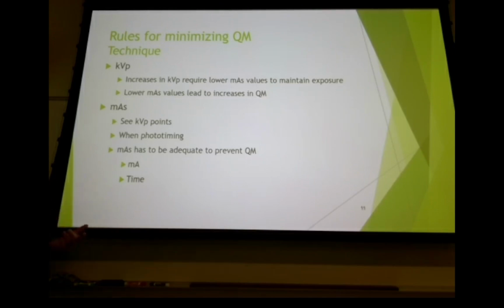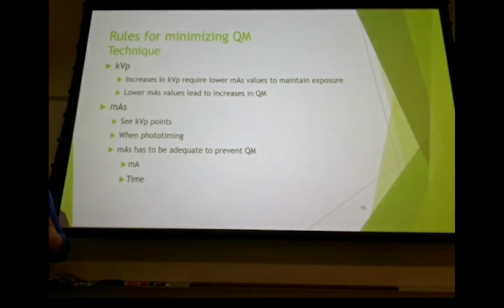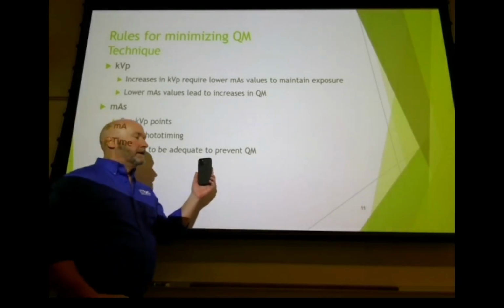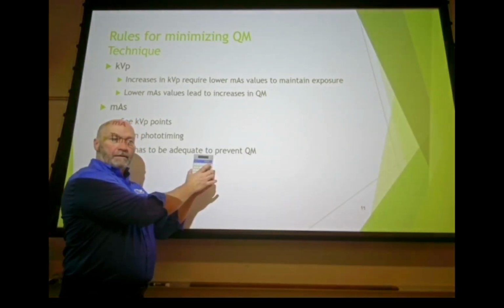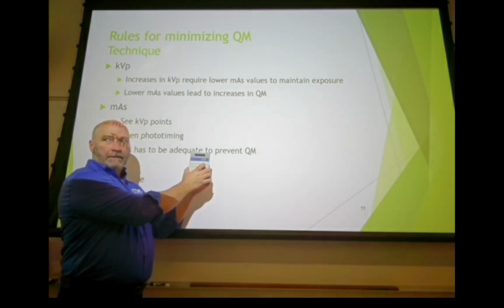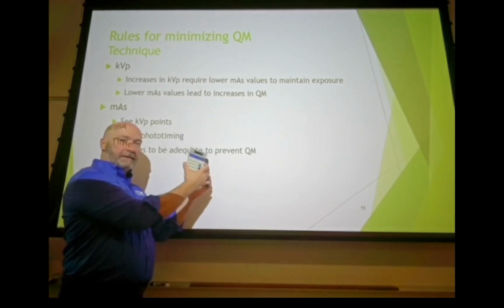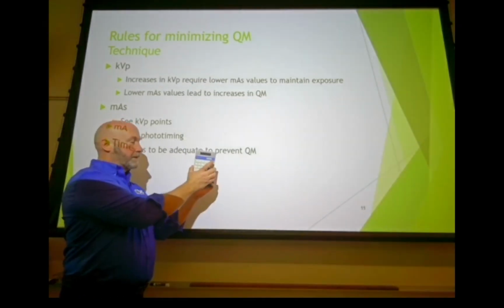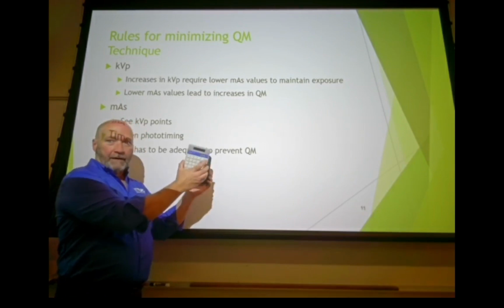If you shot a chest X-ray, well, maybe a chest X-ray is not a good example. Maybe a KUB, all right? Let's say your photocell is this big, okay? And you make your exposure with your L-spine directly over it, then that's the only photocell you use. Is your photocell covering the L-spine? The answer is yeah. So your X-ray beam has to go through the L-spine to get to this, right? All the soft tissue too, but it's got to go through the L-spine in order to get to the radiation detector. And you're going to have adequate exposure.